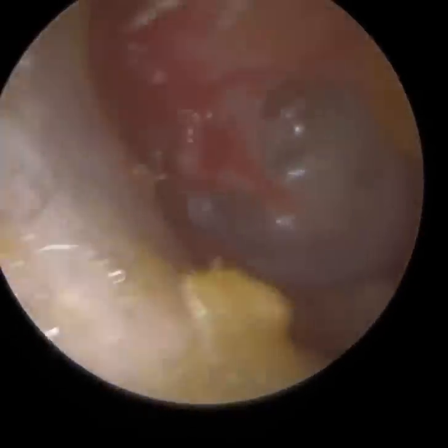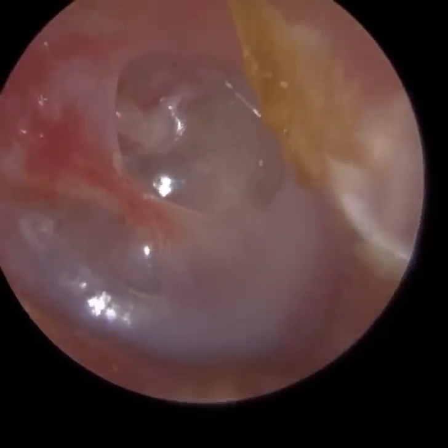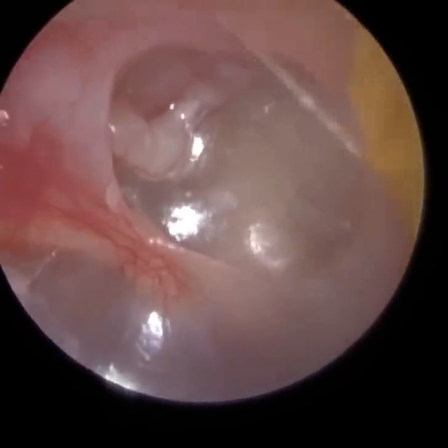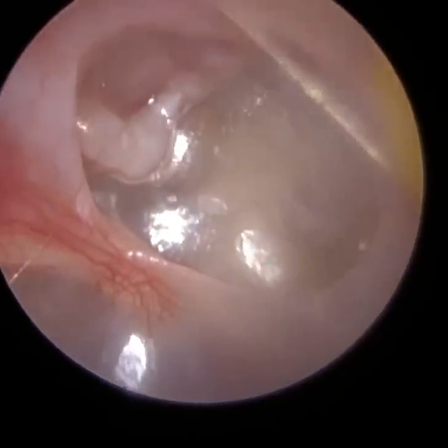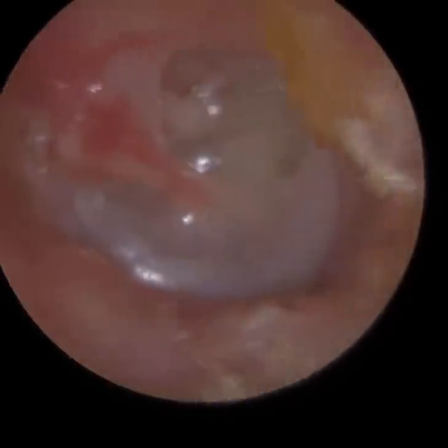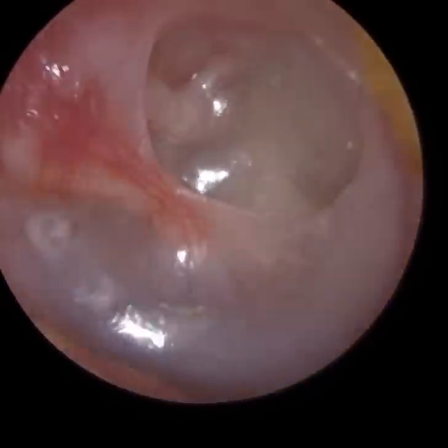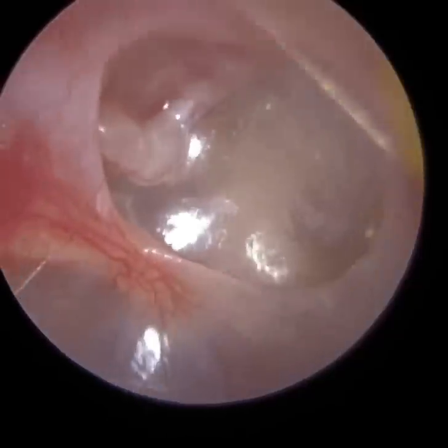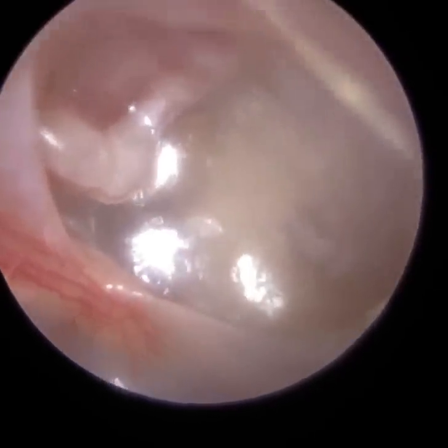In this case, you'll see it in a moment — the back part of the eardrum, what we call the posterior quadrant, has got sucked in. And I'm going to annotate it in a minute. That's not a hole, guys. That looks like a perforation, but it's not. The eardrum is intact, but it's sucked in — and it's quite a severe retraction. It's sucked in so much that the eardrum has wrapped itself around the middle ear structures and even the promontory of the cochlea — like a piece of cling film wrapped around everything.